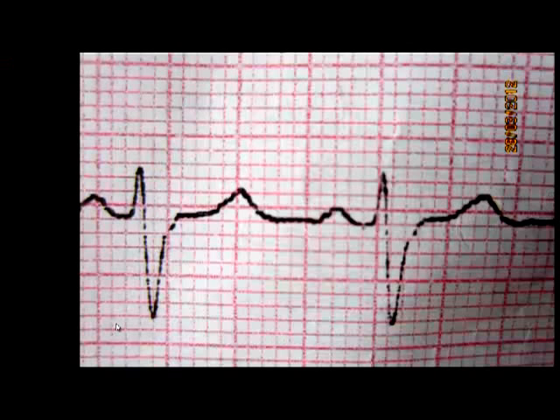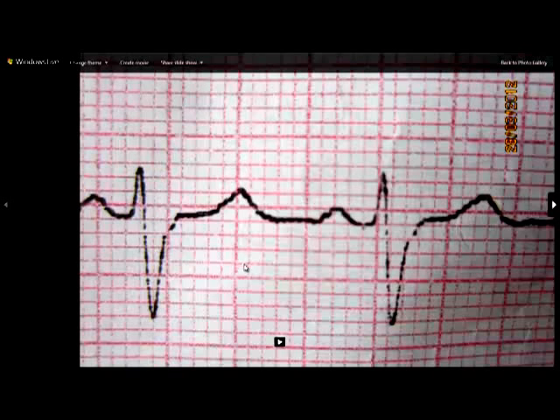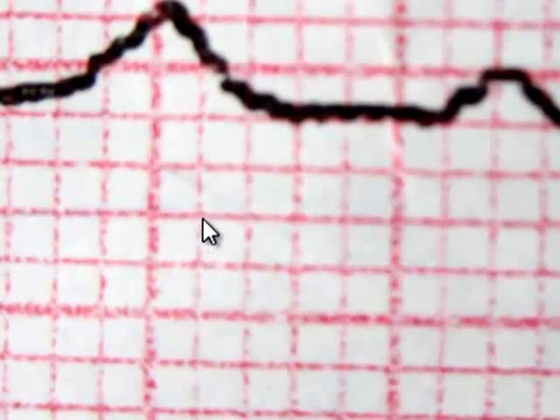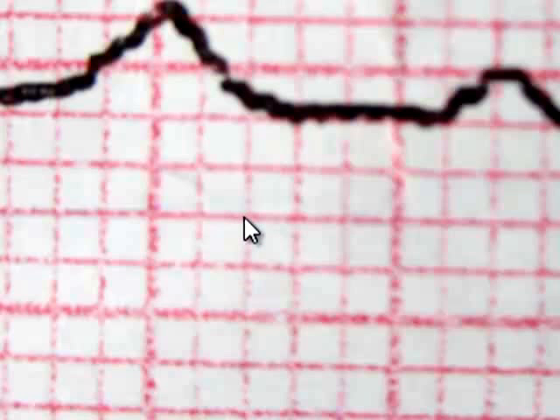On the ECG paper, we see two types of boxes, one small box, which is the square of 1 mm by 1 mm, this one.